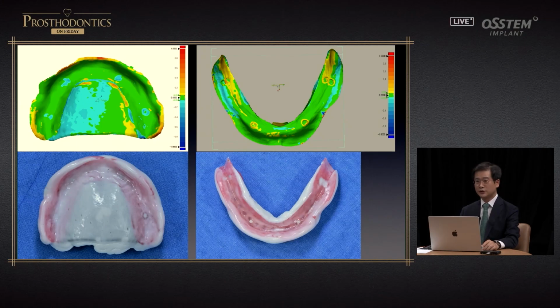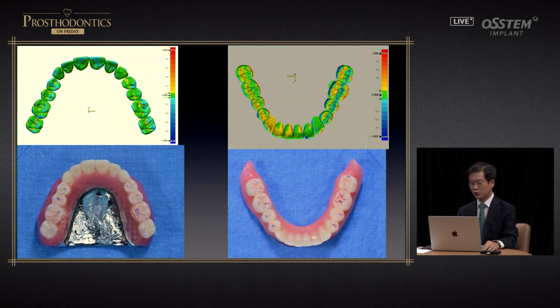The metal framework, artificial teeth, and denture resin could all be hardened using pack and press. Then sometimes the height can be increased, or with the deflasking there could be distortions. But with this approach, all the materials are stabilized before they are worked up. So in terms of tissue compatibility, the occlusal plane areas can be exactly as you have designed, if you have accurate calibration, in other words.